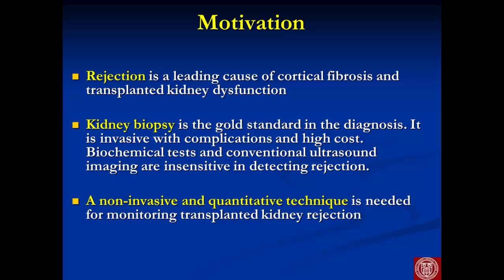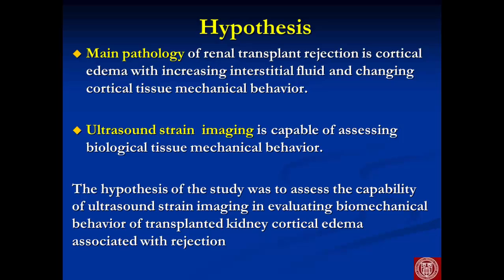Rejection is a leading cause of cortical fibrosis and transplant kidney dysfunction. In the diagnosis, kidney biopsy is the gold standard. However, it is very invasive, with complications and high cost. Biochemical tests and conventional ultrasound imaging are insensitive in detecting rejection. So a non-invasive and quantitative technique is needed for monitoring transplant kidney rejection.